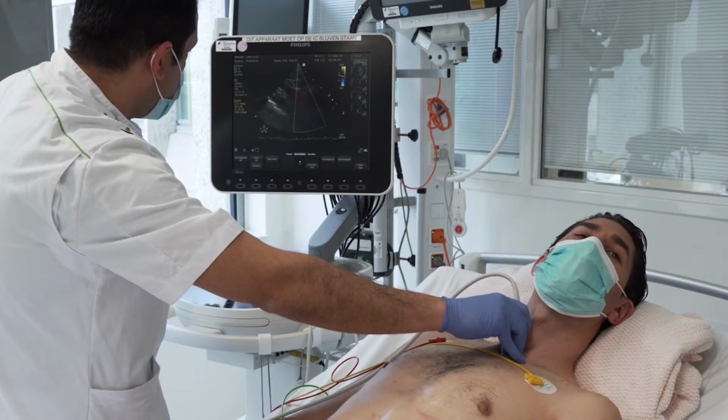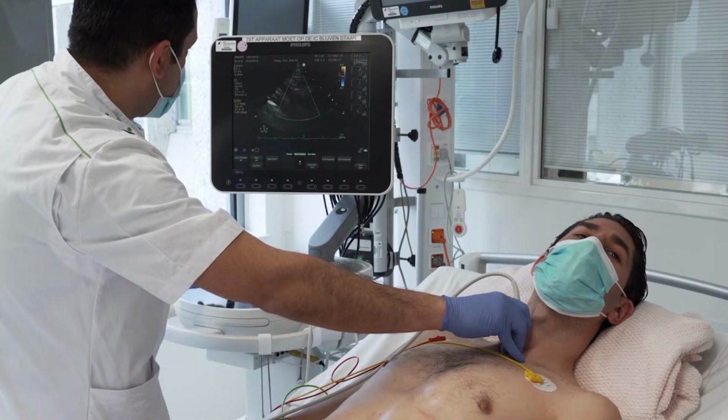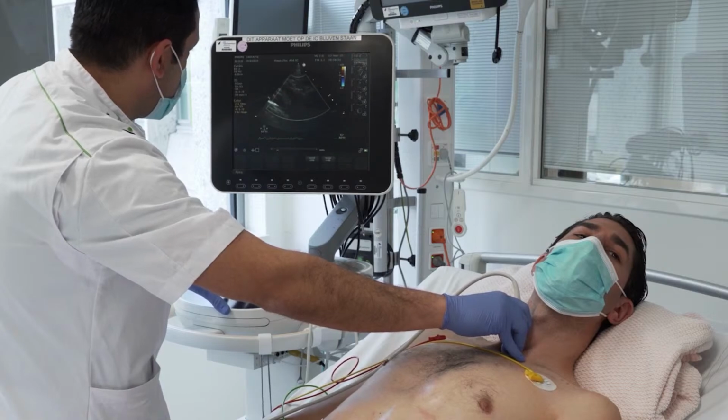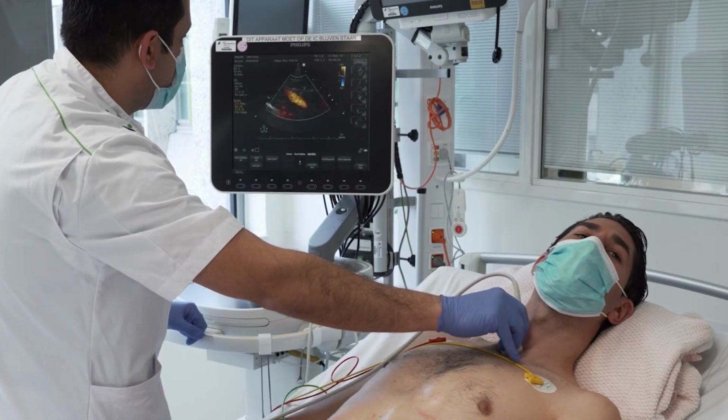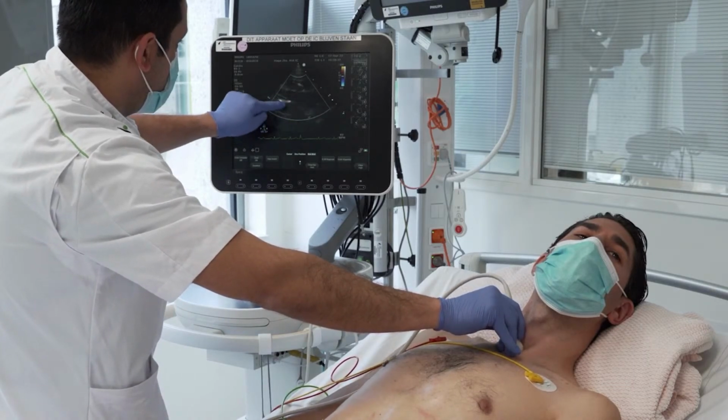And in a type A dissection, you can see the dissection flap very nicely. If you want, you can also do an axial view by just turning the probe 90 degrees. This is quite nice actually. So you see that we are continuously playing with the depth and the gain to get the best view.